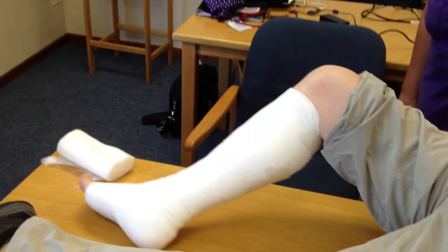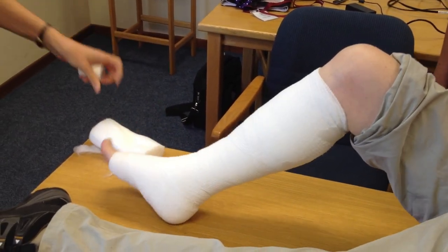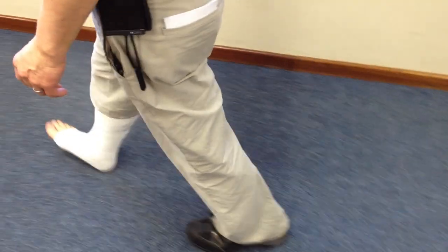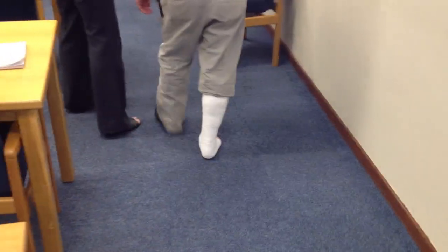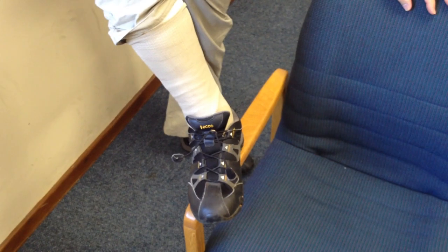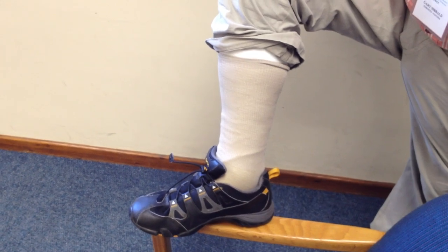And that is it. It's very light and it's flexible. You can walk on it — you can see that it is flexible and very light and not going to interfere with function. We can put the shoe and sock on at the same time as well. This bandage can be worn with a normal shoe and sock without restricting the patient for activities of everyday living.